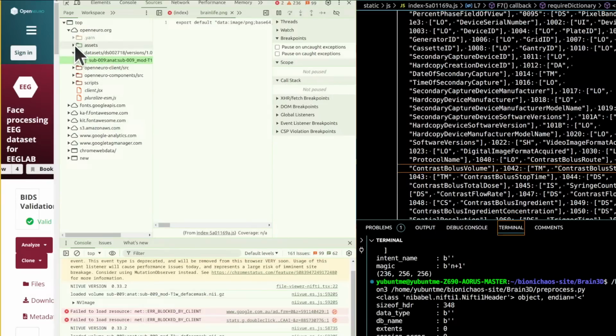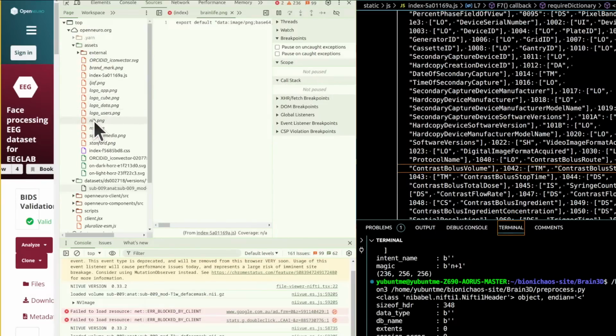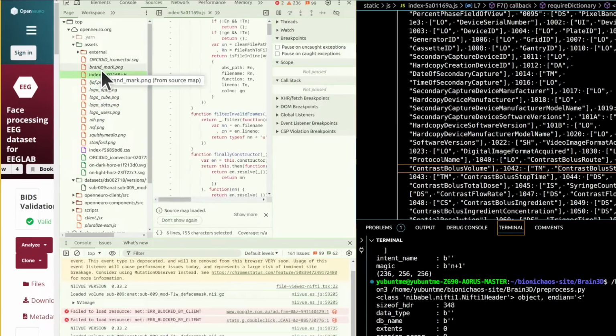Workflow. 1. Pre-process MRI data. Compress and save the data in a format suitable for web transfer and quick access. Generate 2D slices and a 3D volumetric representation from the NIfTI file. 2. Optimize front-end code. Integrate libraries that specialize in medical image visualization. Update the rendering logic to utilize WebGL for performance improvements. Implement lazy loading or streaming of data to allow users to start interacting with the viewer before all data is fully loaded.